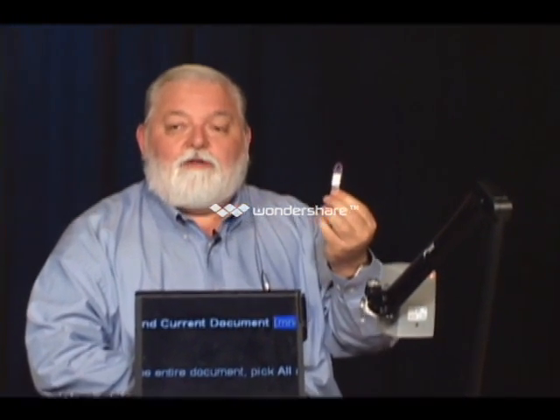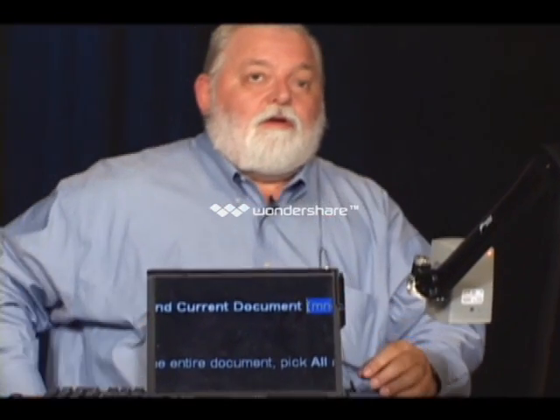Go ahead. If you have a lot of machines you want to put JAWS and Magic on, and of course we all hope you do, hundreds of them, you can get a thing called a dongle. I have one right here. I don't know if you guys can see this or not. This is a little USB dongle, and basically what it is is an authorization key.